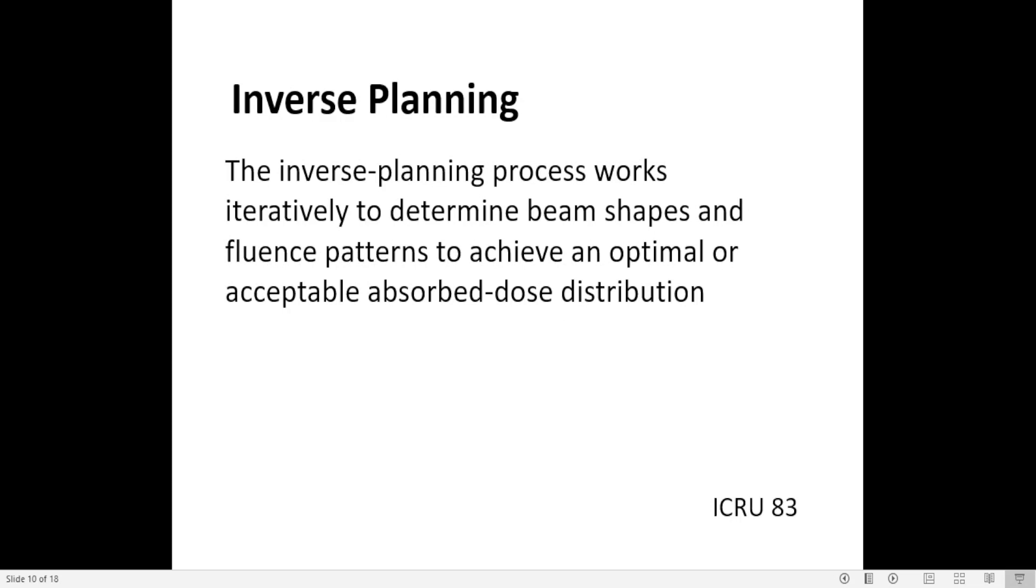The inverse planning process works iteratively to determine beam shapes and fluence patterns to achieve an optimal or acceptable absorbed dose distribution.